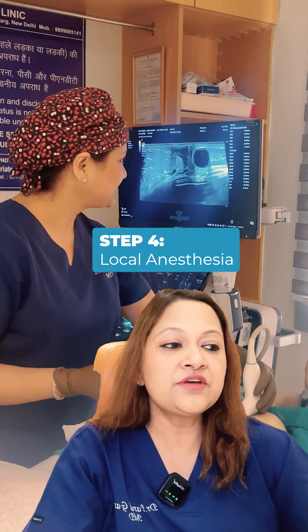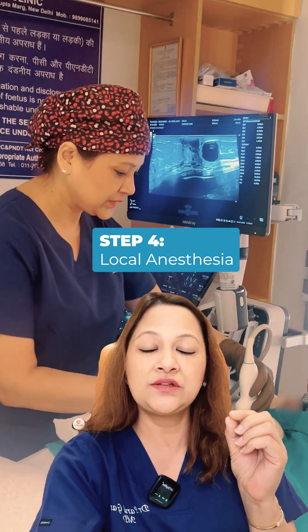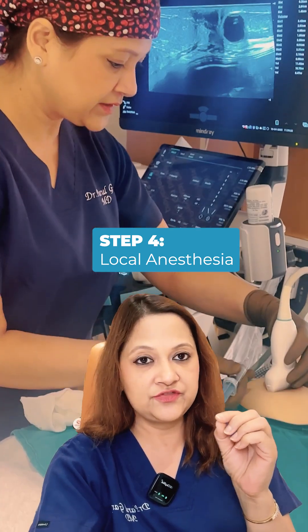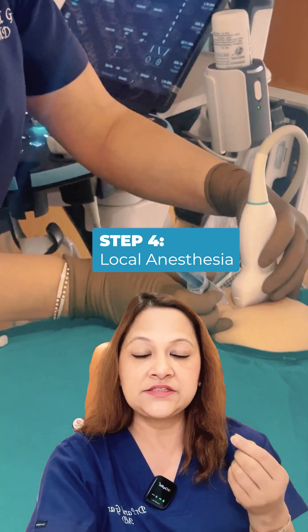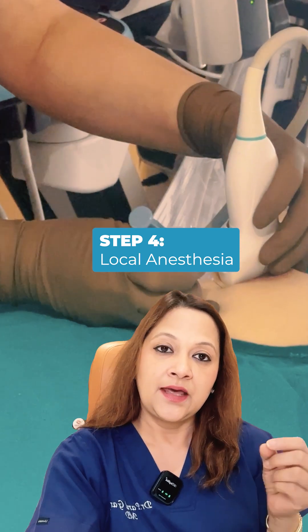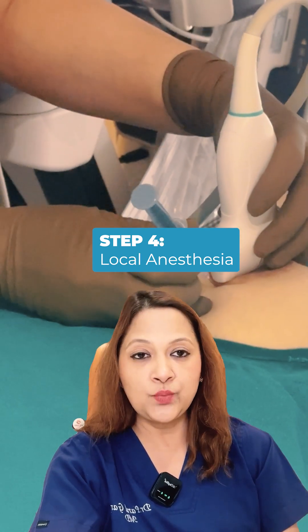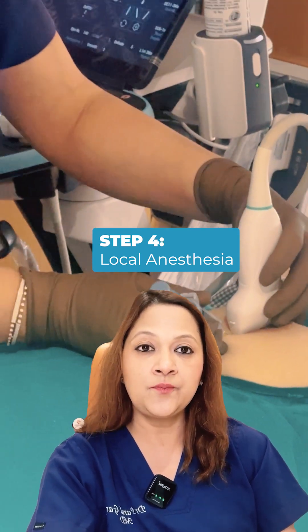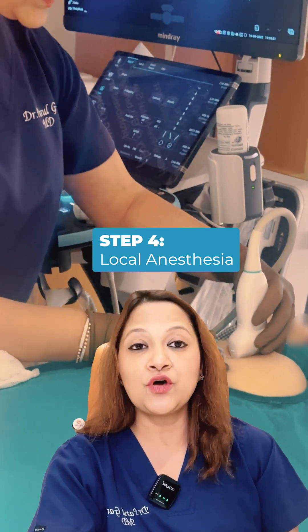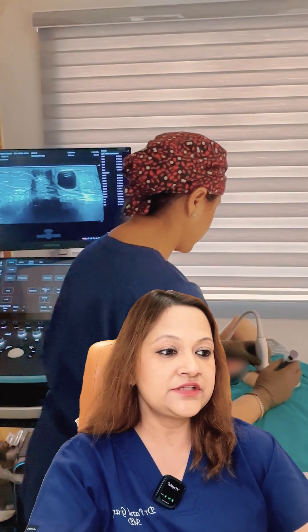Now you can see I am giving local anesthesia with a small thin needle. We inject a solution of anesthetizing agent so that the pain is not felt when we actually insert the needle for aspiration of the liquid.